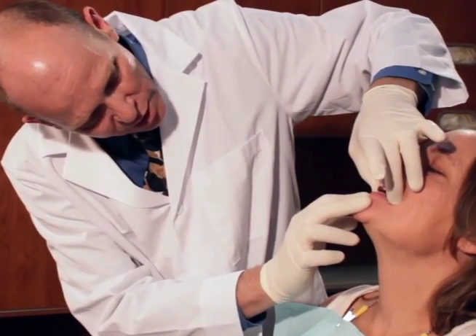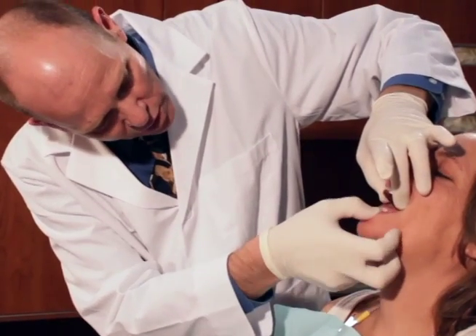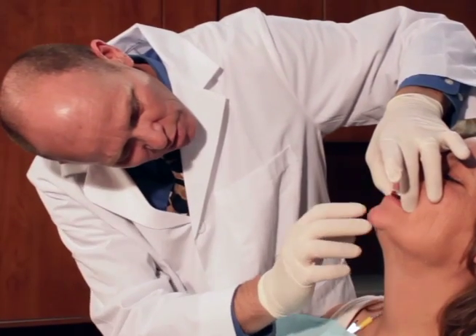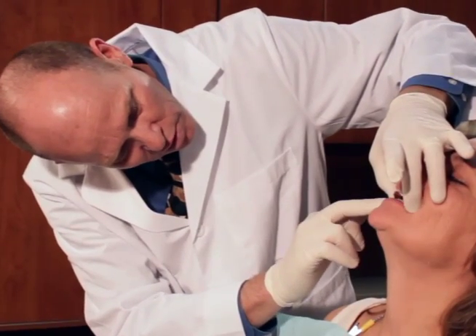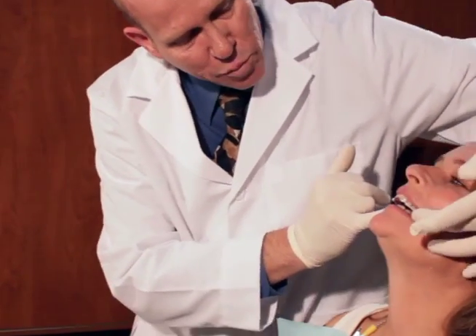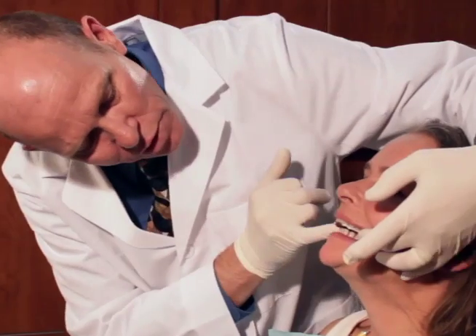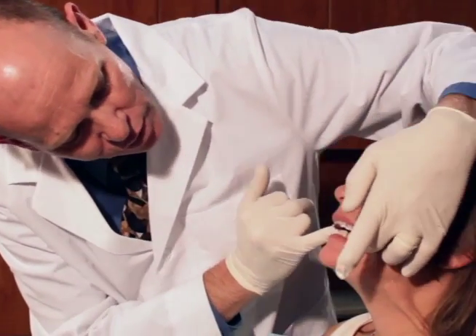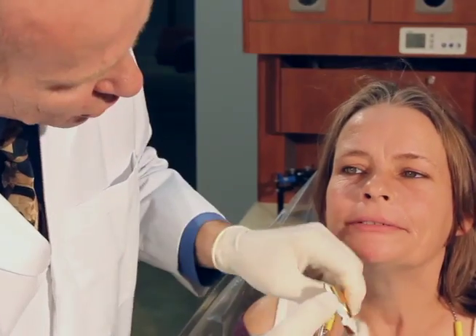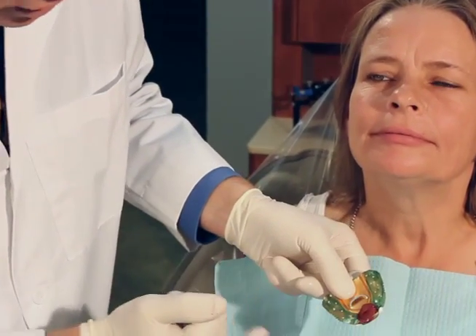Bite back — your back teeth. Open please. Close — we go right into that index. Open and close. Does that feel comfortable? We want to check to make sure we don't have any posterior contact with the posterior teeth, which we don't. So we're good to go to add the bite registration material to the lower posterior half of the tray.